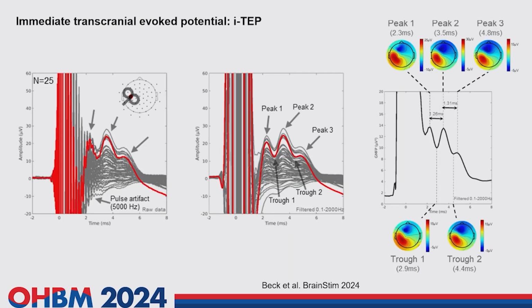So here we are. This is the novelty. And I will tell you what we know about it, but still, we don't know a lot about it. This is the first response that we can measure so far in TMS-EEG. It's the earliest possible so far. It comes from 2 milliseconds on, lasts up to 5-6 milliseconds. It's a slower wave where higher frequency waves are superimposed.